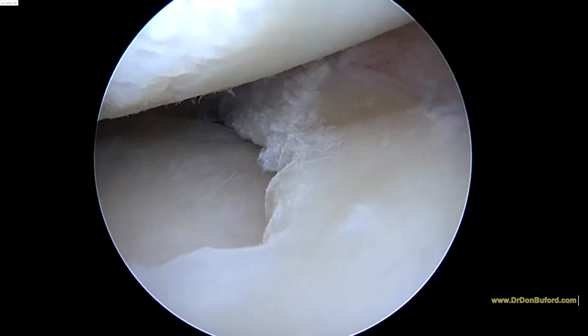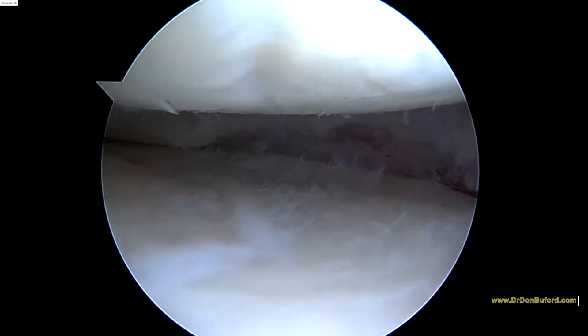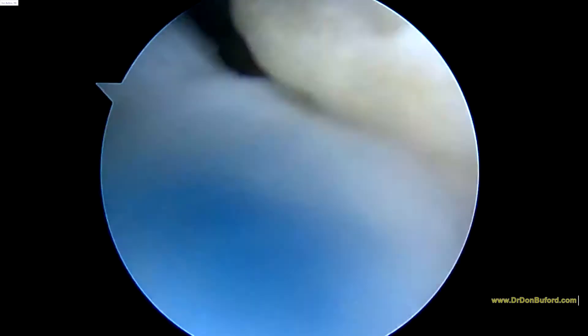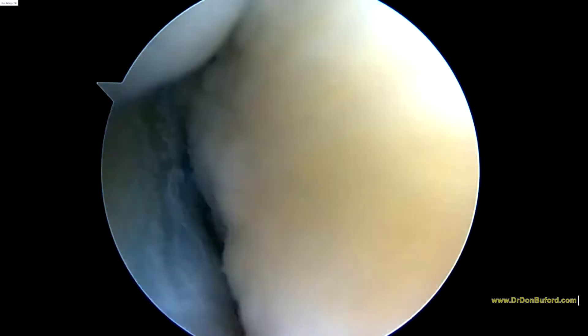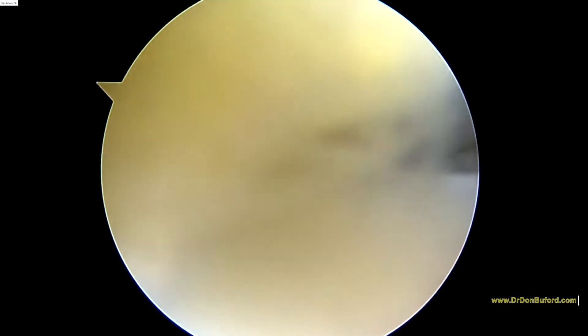You can maybe work a little bit more on this anterior horn, but in the posterior horn we've now got the part that's stable. The ACL looks just fine — intact. We're going to go ahead and look in the lateral compartment next.